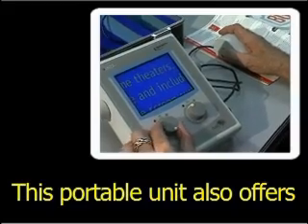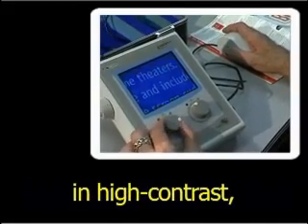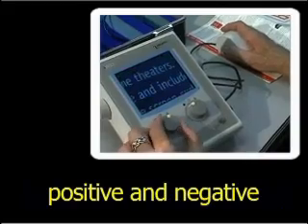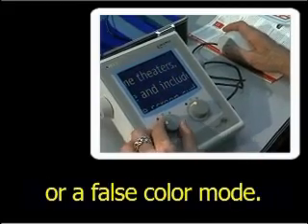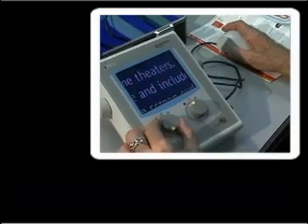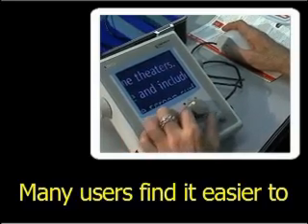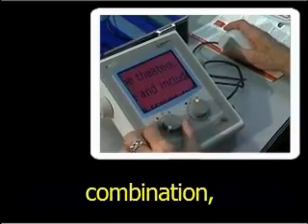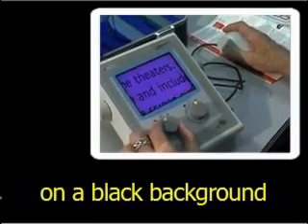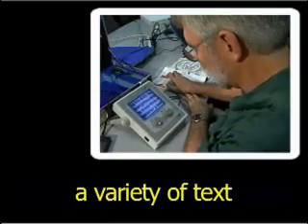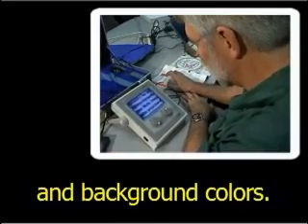This portable unit also offers users the option of viewing in high contrast, positive and negative black and white images, or a false color mode. Many users find it easier to read text in a certain color combination, such as yellow text on a black background, and they can choose from a variety of text and background colors.